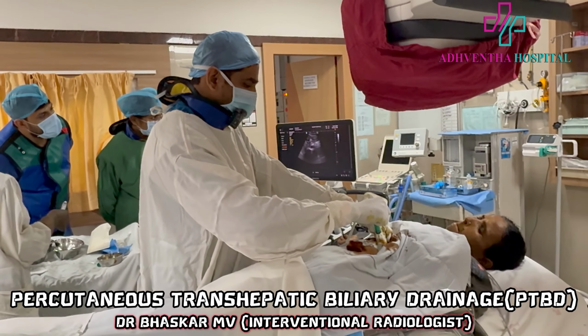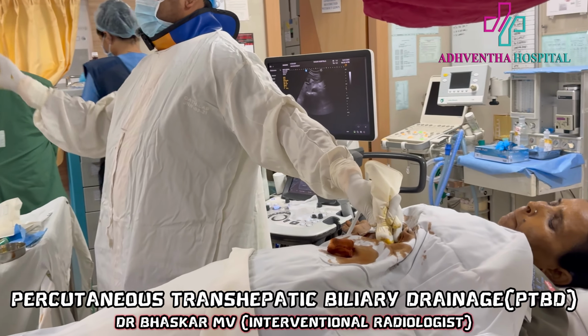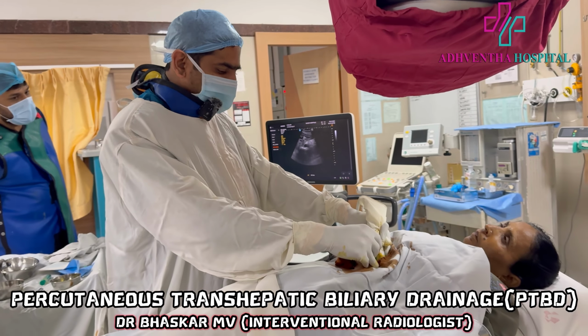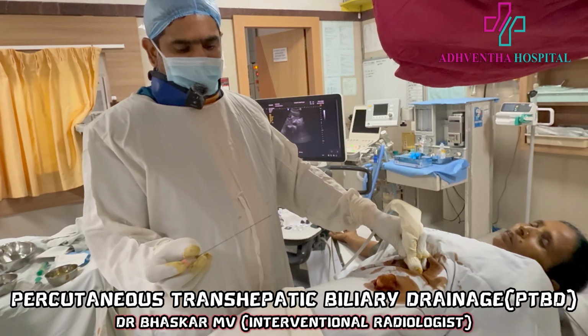So that is the one. Right. Take the biliary set. PTBD set. Can someone open? You want? Any pain? No? Very good. No pain. Okay. Chiba needle.